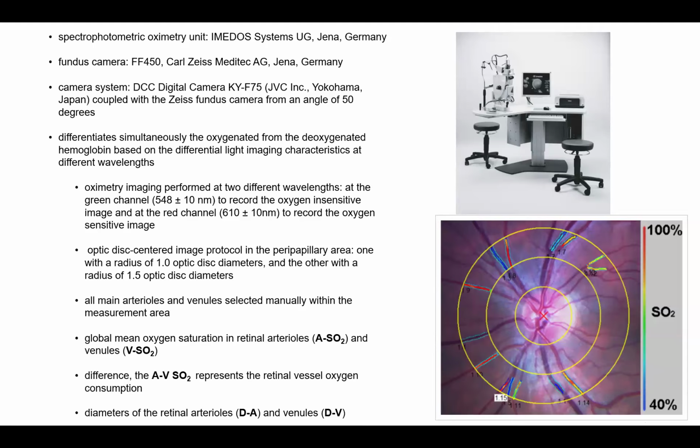And using different wavelengths, this technique allows us to measure the oxygenation in the retinal vessels, in particular in retinal arteries, retinal veins, and the difference between the oxygenation in arteries and in veins, which represents a measure of the oxygen consumption in the retinal tissue. And in particular, this non-invasive technique, which is a kind of modified fundus photography, once again, can perform the measurements in the retinal vessels surrounding the optic nerve, so at the posterior pole of the eye.